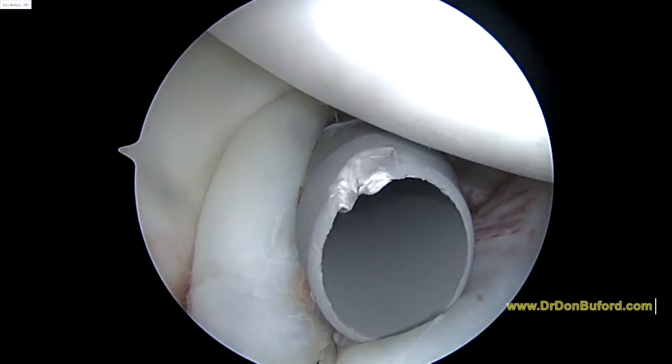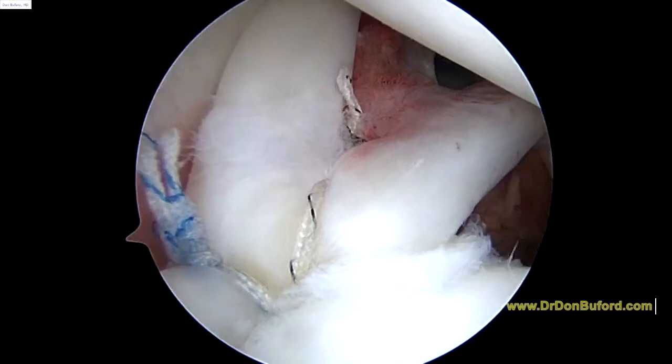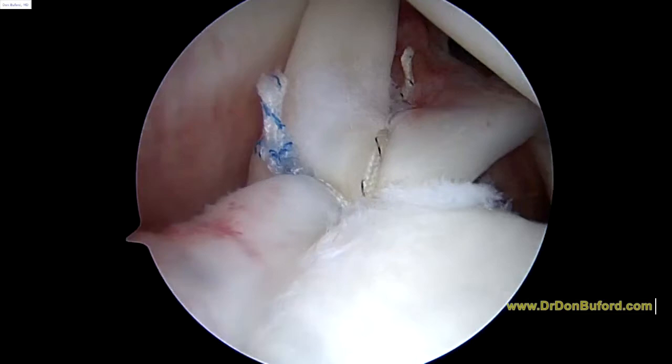We do have a nice, secure fixation on the biceps. There it is there. As we rotate the shoulder, that's not going anywhere now — as we rotate, you can see that's rock solid. So I'm very happy with the way that looks.